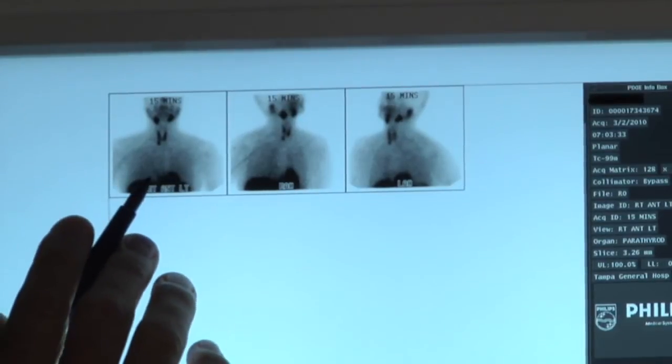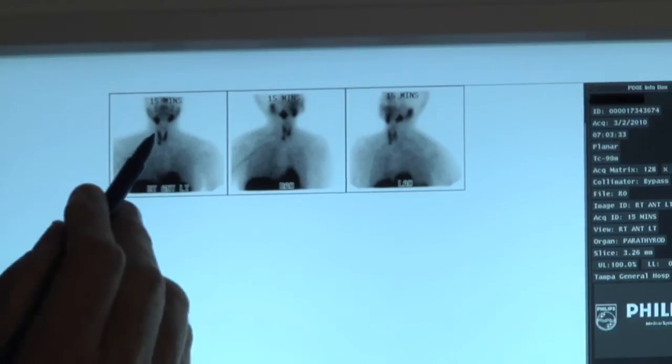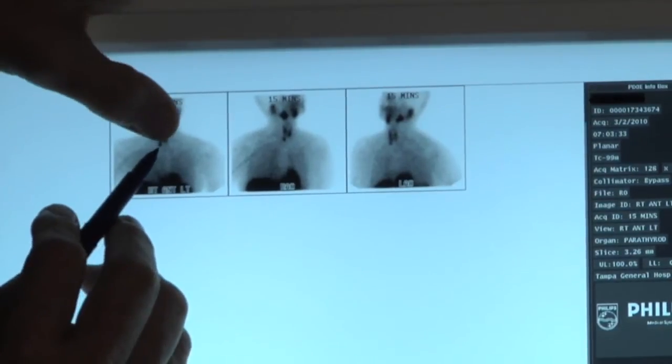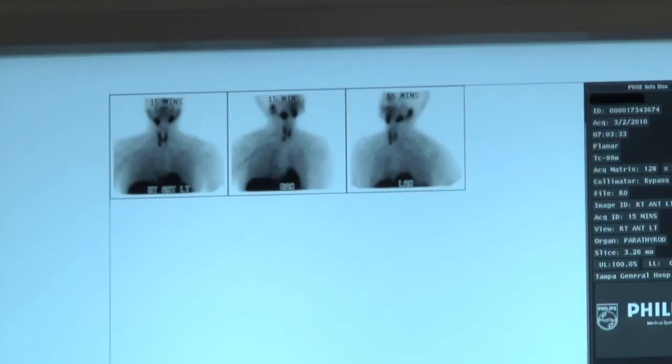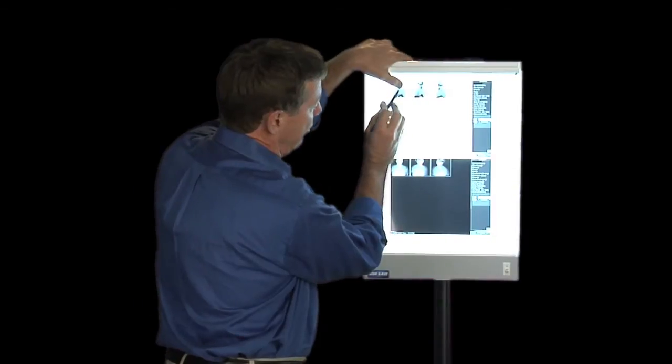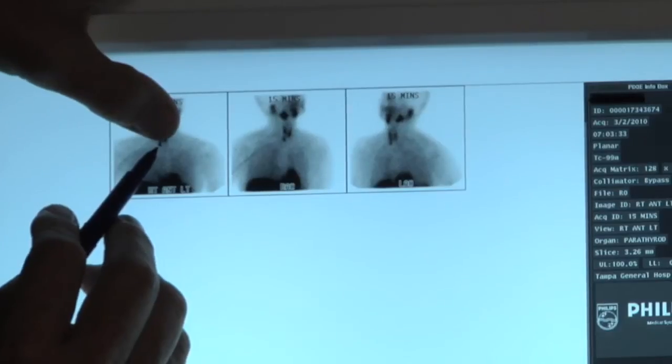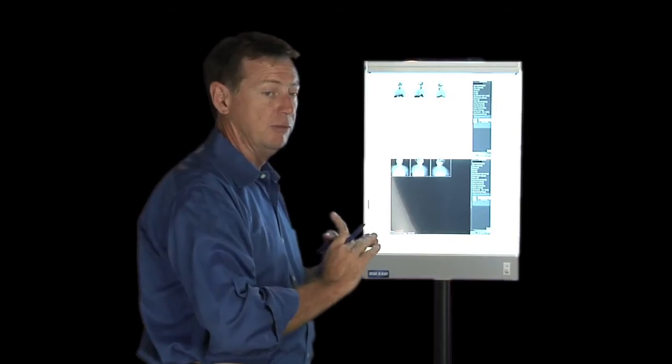So we've talked about some of this before. The parathyroid tumors can be anywhere in this big box. We've discussed that in the past. The butterflies, the thyroid, right there is this patient's parathyroid tumor. A clean, crisp, in-focus scan is what you're looking for.